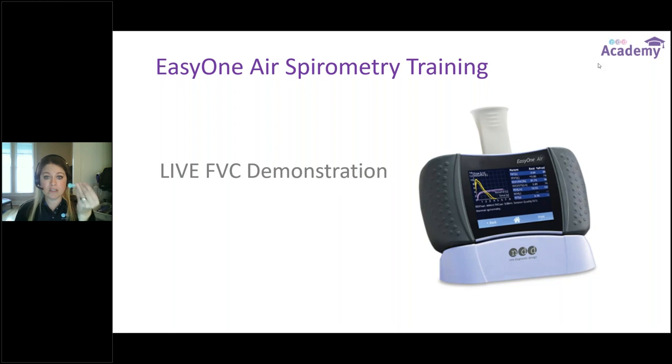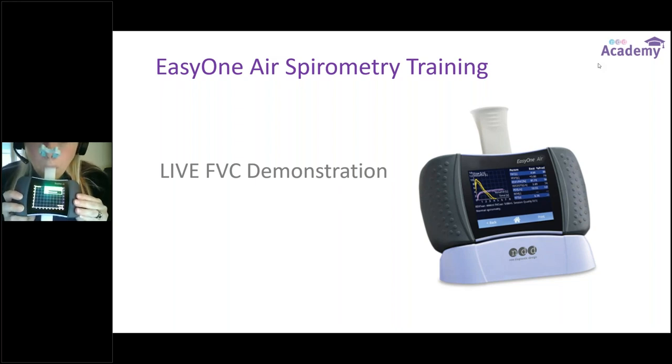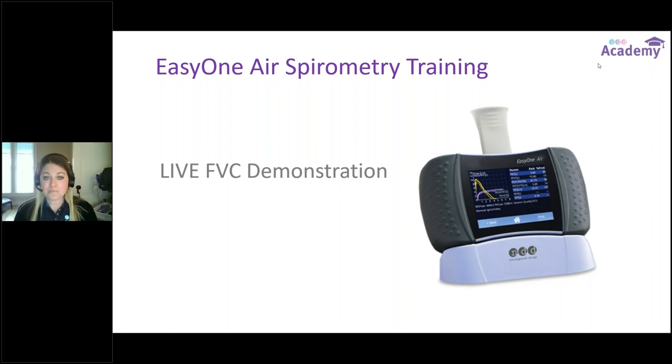Nose clips on, good tight seal, teeth on top, tongue on bottom — biggest breath possible and immediately blast it out as hard and as fast as I can. The audio cues indicated I was finished with that trial; I had reached the point of plateau and emptied my lungs completely. The coaching bar again says good effort, due next, and starts to pull in some preliminary data — a session quality grade and parameters like FEV1 on the coaching bar. We don't want just one trial; we want three that are both acceptable and reproducible.